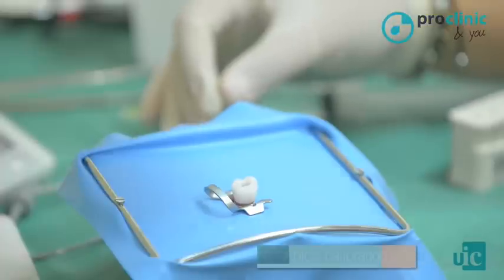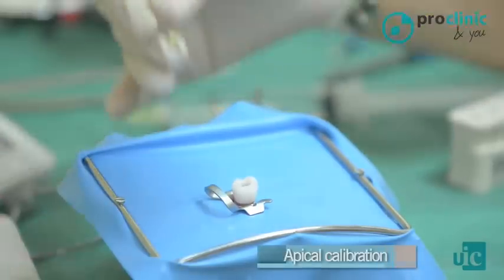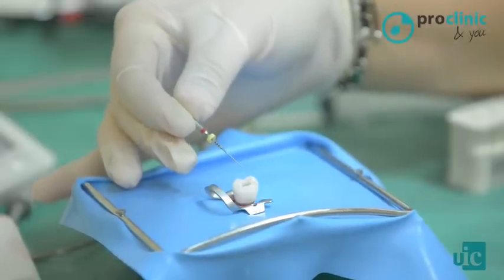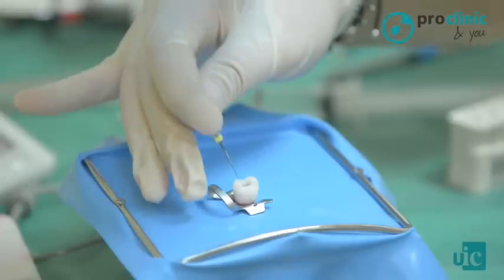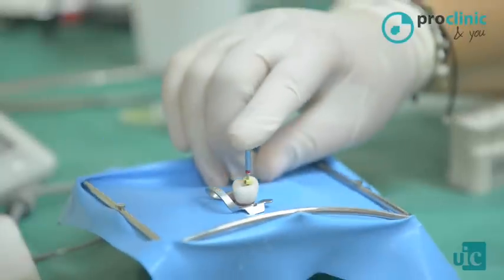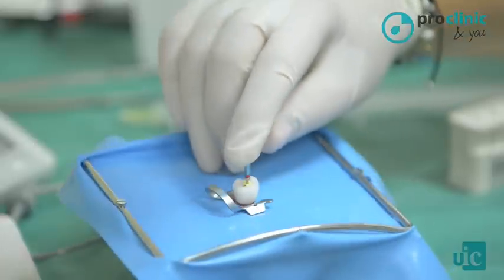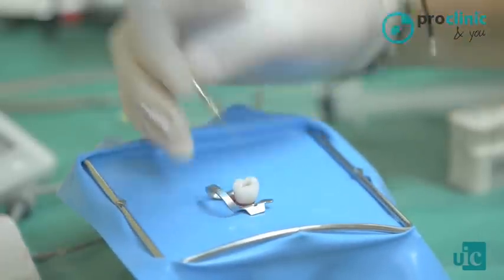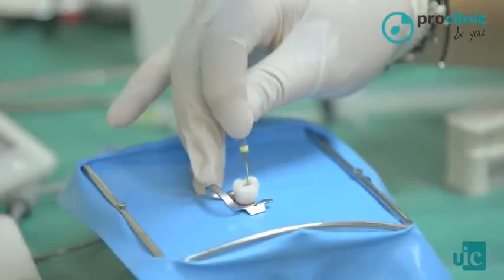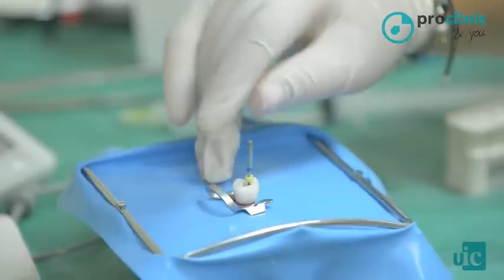The apical calibration determines the diameter size of the root canal at that level. To establish it, we introduce a file of the same gauge as the master file, but with smaller taper, and we introduce it onto the apex with mild pressure. If we notice that the file goes through the apical foramen, we need a bigger file. In this case, we are working with a 30 gauge file, and we should do the same with bigger files till finding the one that does not go through the apex.